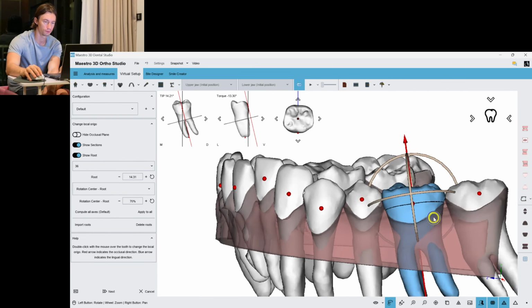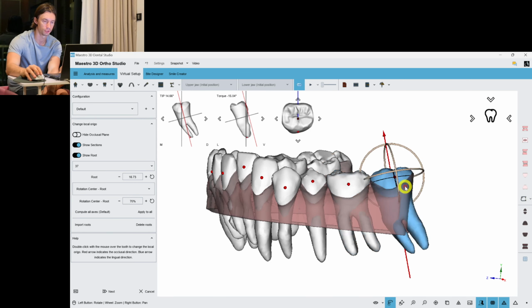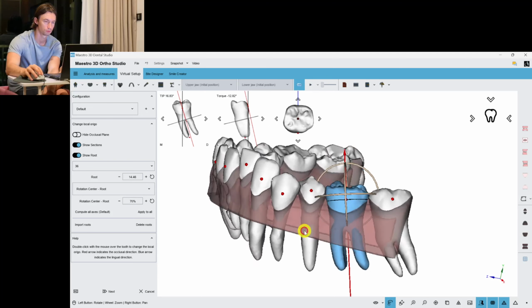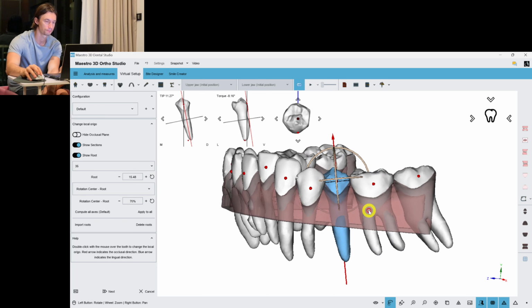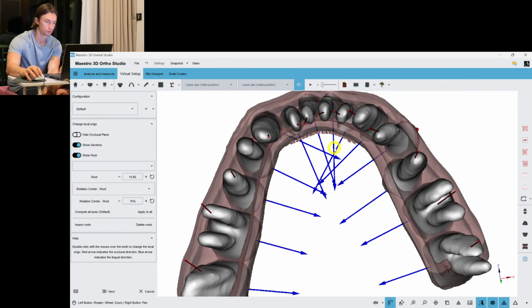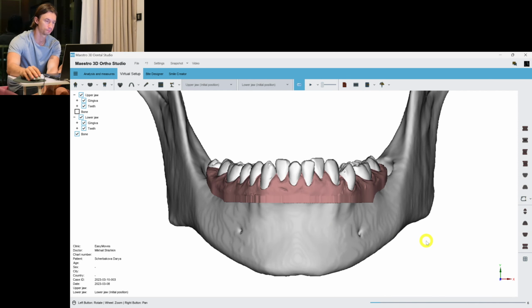And left molars I'm going to distalize with the distal tipping movement. That's why I place the axis this way, so I follow the tooth anatomy. Well, let's check the torque. Torque is fine, and we can proceed with the upper jaw.